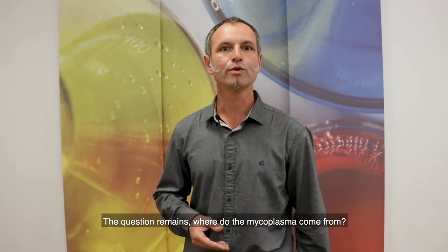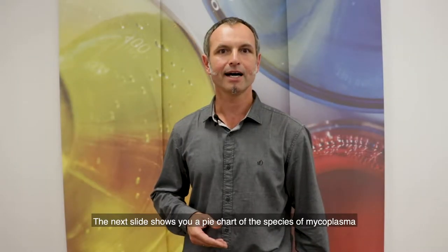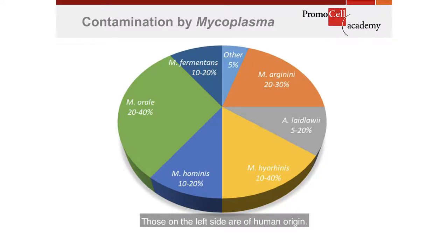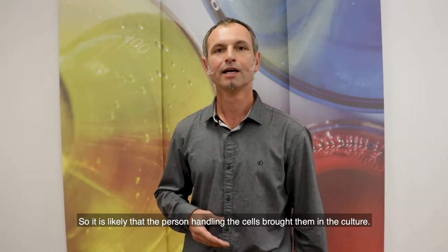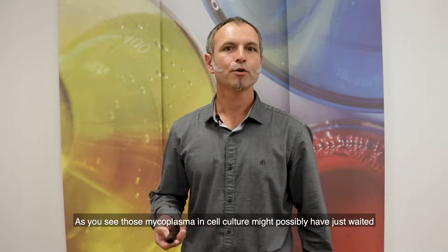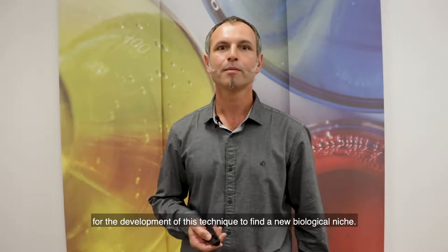The question remains: where do the mycoplasma come from? The next slide shows you a pie chart of the species of mycoplasma most frequently found in cell culture. Those on the left side are of human origin, so they live on human epithelia, meaning it's likely that the person handling the cells brought them into the culture. The other species found in cell culture are of animal origin and may have come from animal-derived supplements.